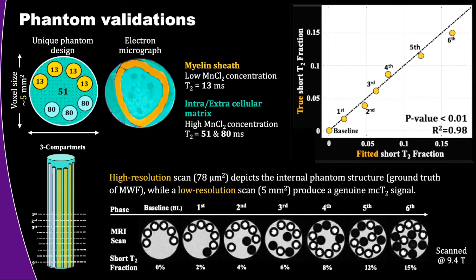I think that the water that resides between the myelin sheath does have different properties than the free water pool. Another work that we're doing now is looking at an in vitro model of myelin. But I couldn't really say what happens on a GRE sequence, whether the T2 prime changes between the intra-extracellular water and the myelin water.